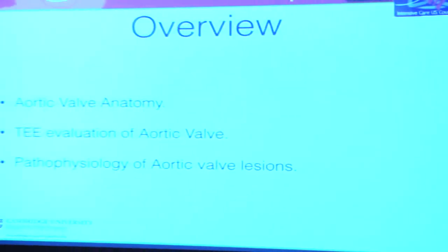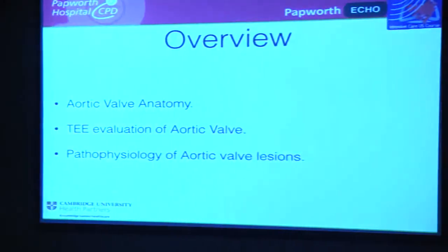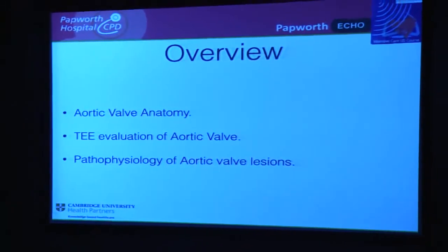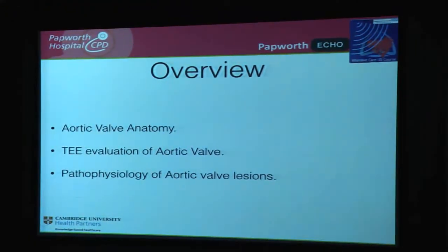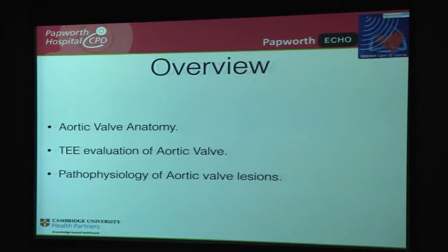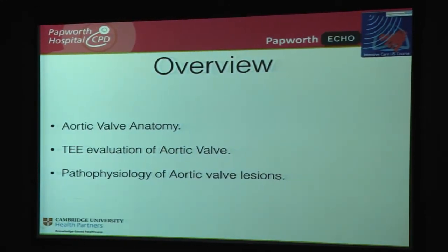Anyway. Moving on, I don't have any disclosures. What I'll be talking about is essentially aortic valve anatomy. We'll be discussing the evaluation of the aortic valve by the transesophageal route. And I'll be talking very briefly about the pathophysiology of aortic valve lesions.